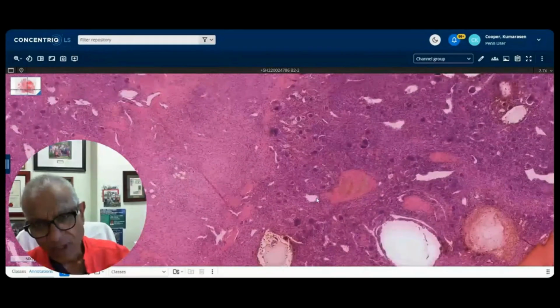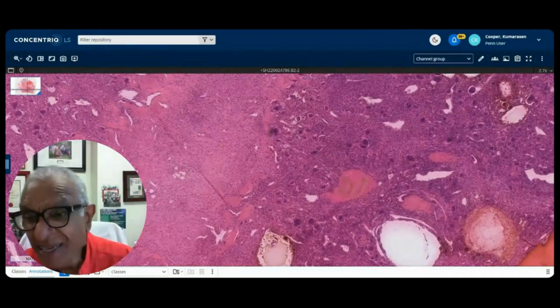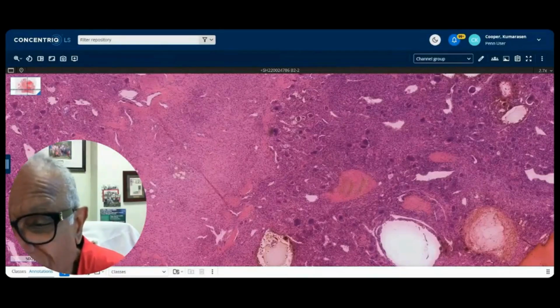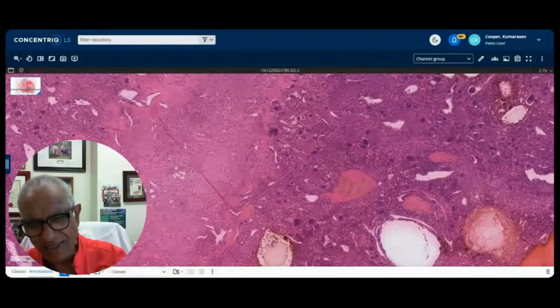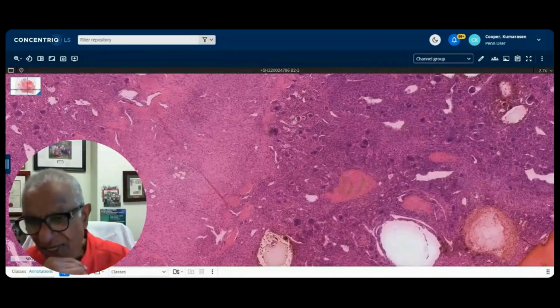And again, I'm not referring to the low-grade versions like the low-grade intramedullary osteosarcoma. I'm talking about the osteosarcomas that look ugly, high-grade, with osteoid production in a background of malignant-looking cells. Remember, they can have a range of morphologies. You know all of this. They can look like giant cells. They can look like cartilage. They can look spindled and even epithelioid. So there is a whole range of that high-grade morphology that you see in osteosarcomas.